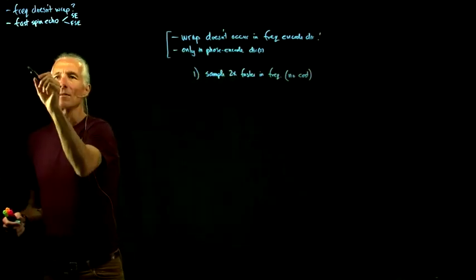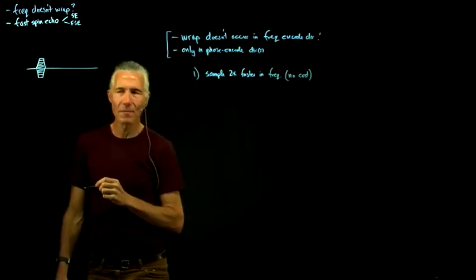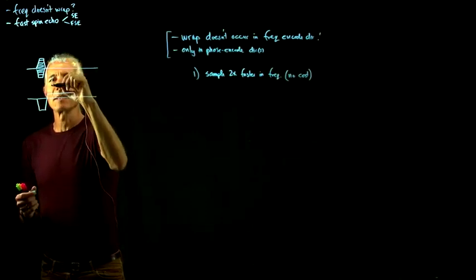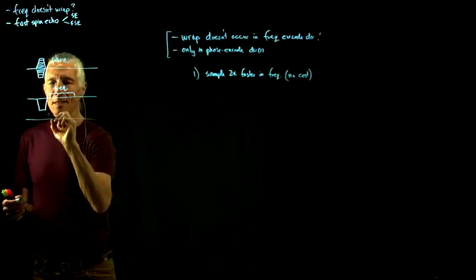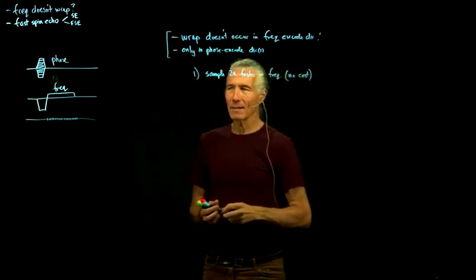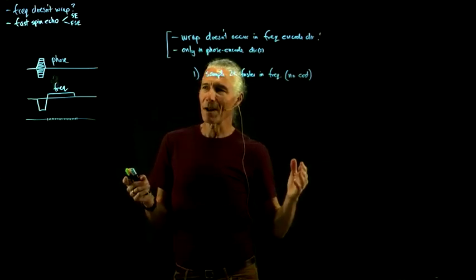So let's just draw the phase encode and the frequency encode. Here's the phase encode part, which we do after the RF pulse, but before we start recording data. And then here's the frequency encode part. So basically, without losing any time, we could sample at that rate, or we could sample it at twice the rate, oversampling. That doesn't cost any time. And we know what that will do: it will expand the field of view. That doesn't stop the wraparound, but it moves it further out.